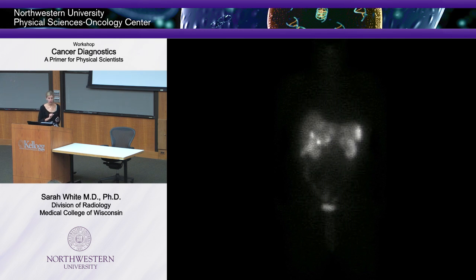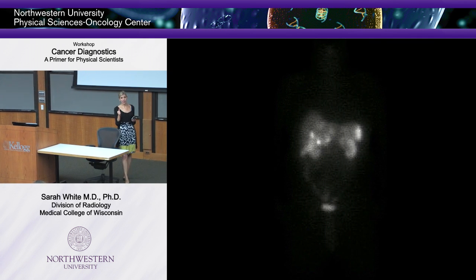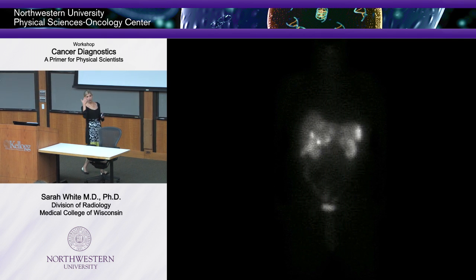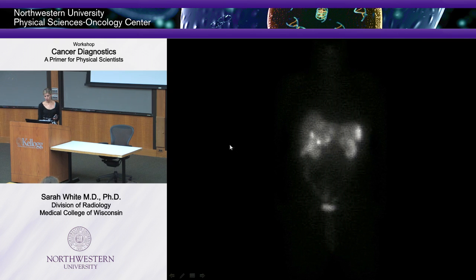We're getting there. The other thing we can do is to see if he has disease anywhere else. So we treat these patients that have neuroendocrine tumor with octreotide. And octreotide, we can do an octreotide scan. So basically, like we did the PET scan before, or we did the thyroid scan before, we can couple a radiotracer to octreotide, and that will only go to cells that make octreotide or have this receptor on it. And so we did an octreotide scan to see where else does this guy have disease? Does he have metastatic disease everywhere else, or is it just in the liver? Turns out, as you can see, it's just in the liver.